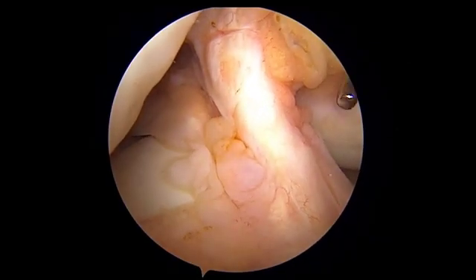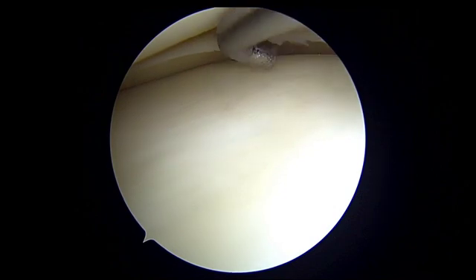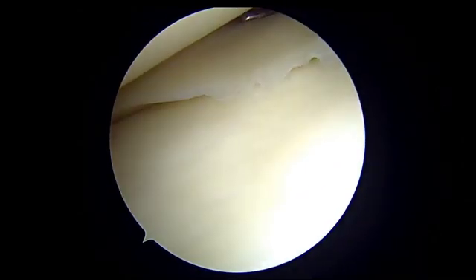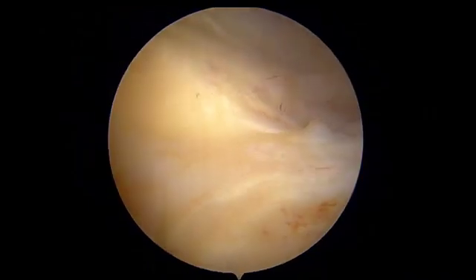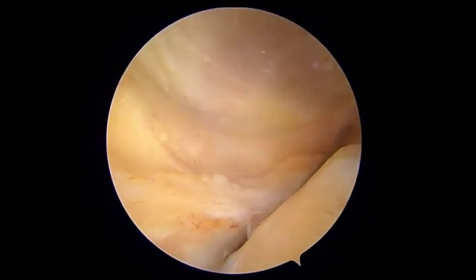A diagnostic arthroscopy is performed and the menisci are palpated. The medial meniscus is normal on probing. Using the Gillquist maneuver, once we enter into the posteromedial compartment, we can see a huge ramp lesion, which is further confirmed by doing a needle test.